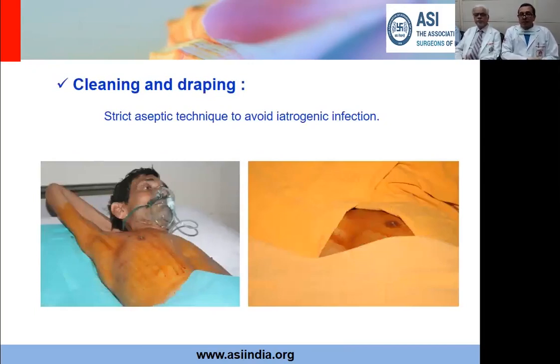As I said earlier, all aseptic precautions need to be taken, and please look at the area on which the iodine has been put. I would do a pre-cleaning. We will ask the patient to clean up that area if there is a lot of dirt. Then we will do the first cleaning and then we paint with iodine, going to quite a wide area just the way we do in an operative procedure. And as you can see, there is a sterile towel which has been placed behind the patient, and then we drape the area just as we do in surgery so that all the sites are covered with sterile drape.